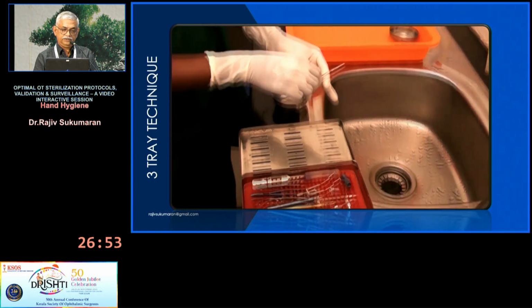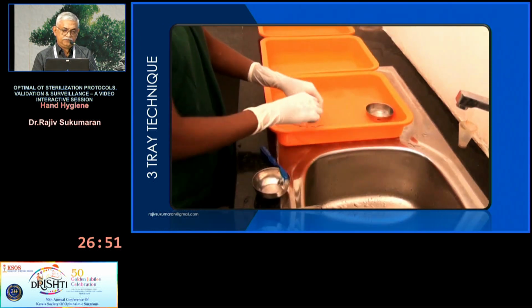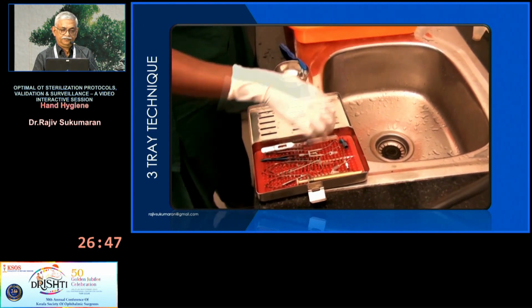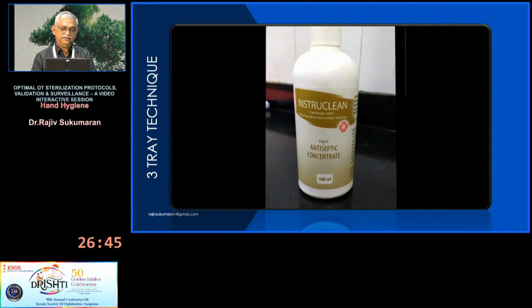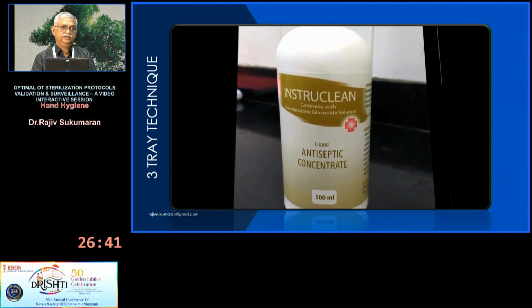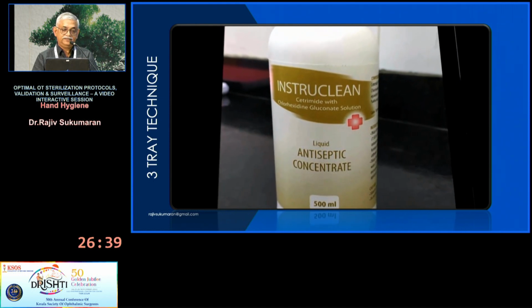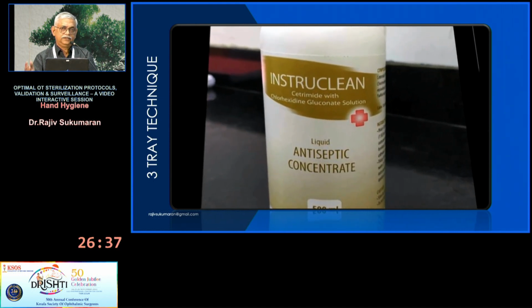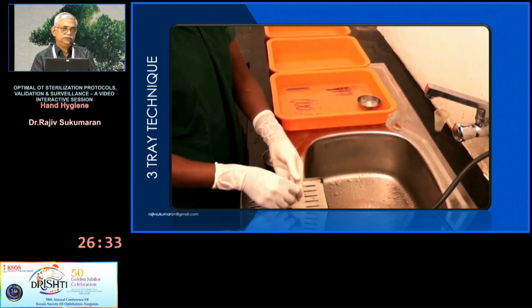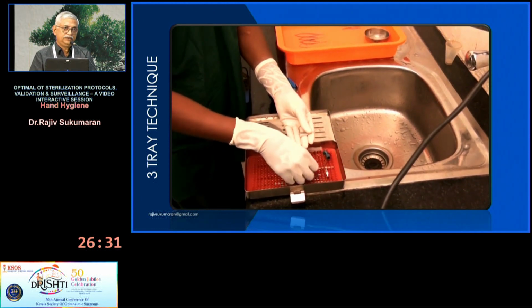Now just soak the instrument for a few minutes there and be very gentle. This is what I was talking about, InstruClean, which is available with the Oral Lab. It is nothing but cetrimide, which is commercially available as Savlon. You can use that. Dilute it and use it.